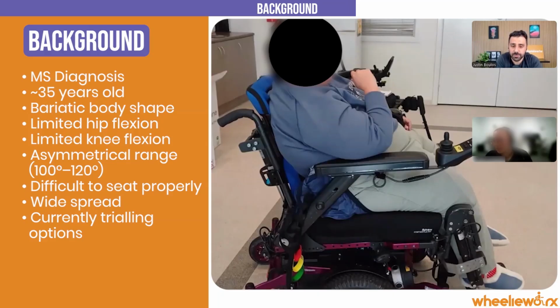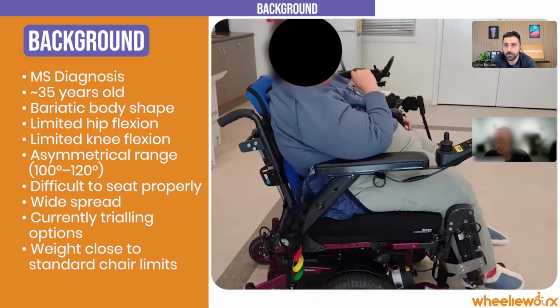So first of all, what's her current weight? 120, I think. 120 last time. Okay, so that's good because that means we're still open for all the non-bariatric equipment. So the M3, the Quantum, all the Magic, all that's got 150 kilo weight capacity. So we don't have to go a HD chair because a lot of these chairs are rated to 150 now. She was last about 120, 130. So she's getting close there. HD is something that you want to explore, but if her weight's not aggressively getting bigger, then yeah.